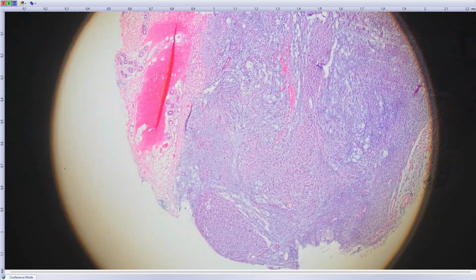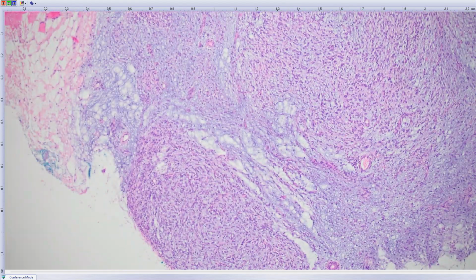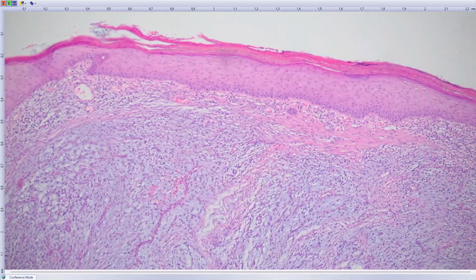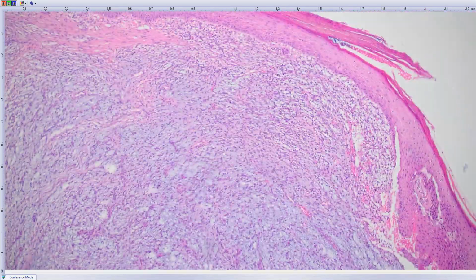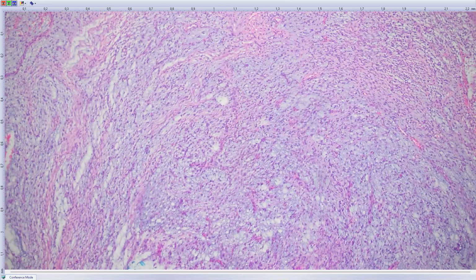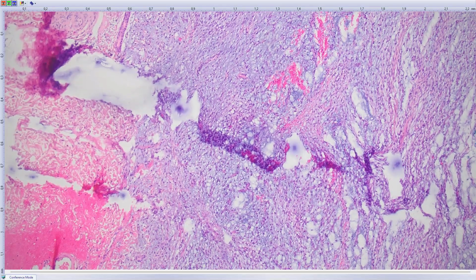So when these tumors are multiple, they can be associated with Carney complex, but most cases are solitary, not associated with any syndromes. So superficial angiomyxoma. Immunohistochemistry is not very helpful for the diagnosis. Some cases may have loss of PRKAR1A staining, but most people don't have this IHC in their lab.